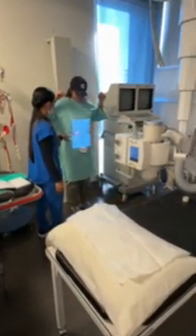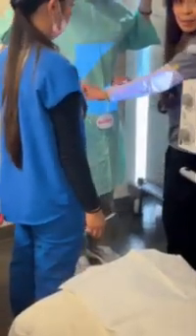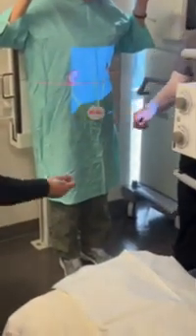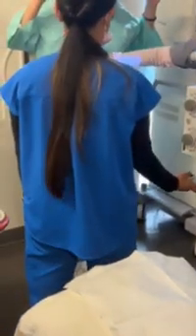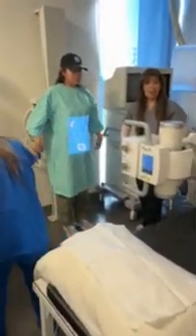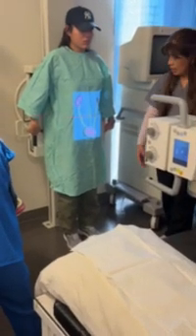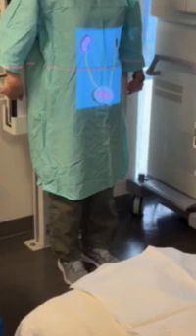So we might have to reposition, the kidneys are a little too low. See how the kidneys move when the patient stood up? So mobility of kidneys. Maybe we're gonna go a little bit lower with our centering, because now remember, you might center a little bit lower than the iliac crest because when the bladder moves down, you wanna catch all the way the prolapse. So this will be your upright post void.